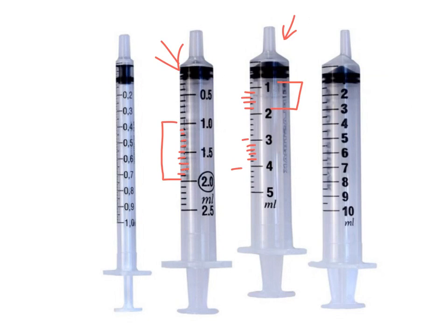The ones like this one are a little bit easier because they're counted off in whole numbers, so obviously the lines in between would be halves. So it would be 4, 4.5, 5, 5.5, 6, and so on and so forth. So those are a little bit easier. Like I said, the biggest one, I think, is knowing the difference between these two.